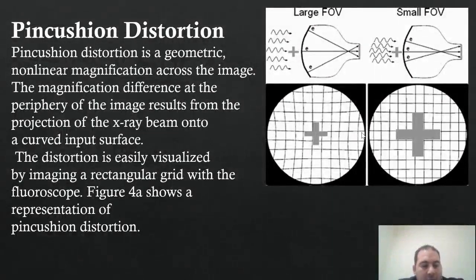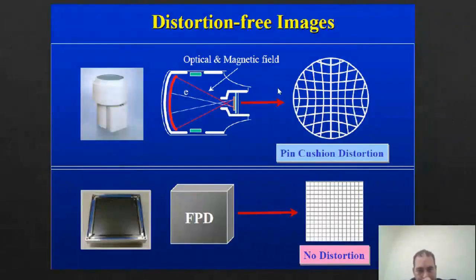So, what happened here is due to what? Or as a result of what? The pincushion artifact or distortion. That's it. As a result of having some of the electrons present in that periphery area, particularly in the outermost region, they will concentrate at a location that is significantly further away than the focusing that occurs in the normal beam.